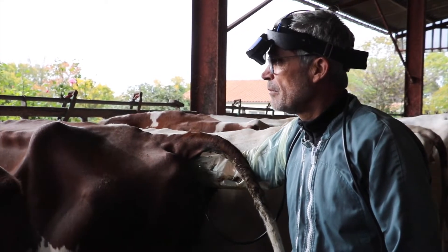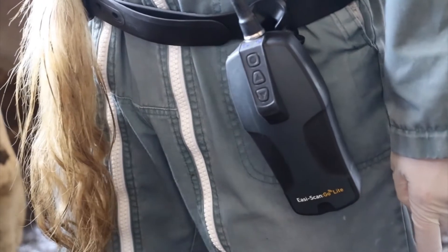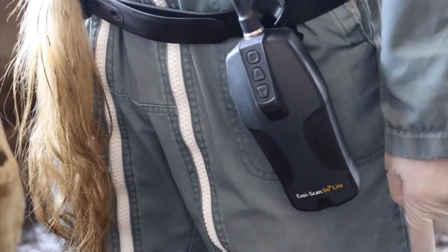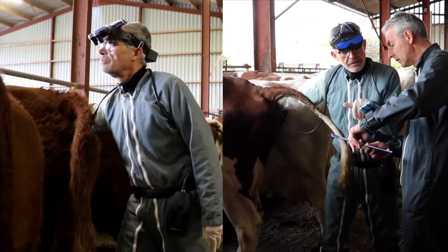That's why you need a scanner that's capable of withstanding the most challenging conditions and demands — a scanner that will deliver every time, whether you're working on a beef farm or on a dairy farm.